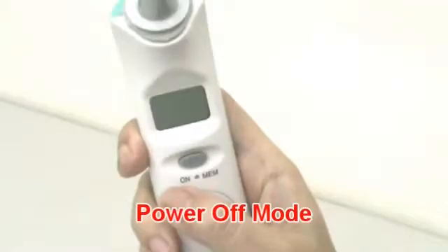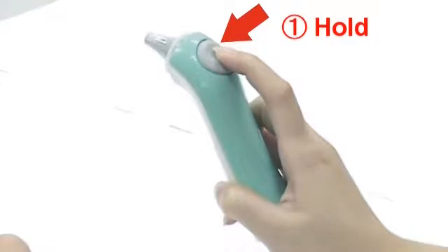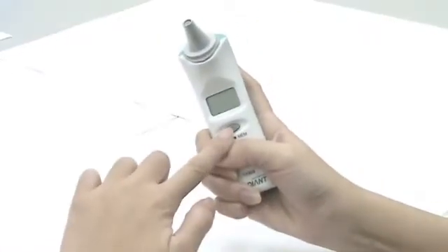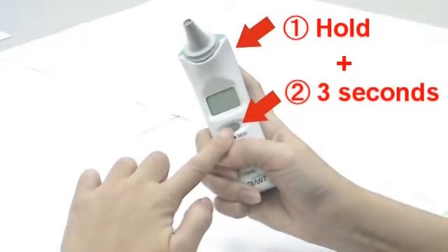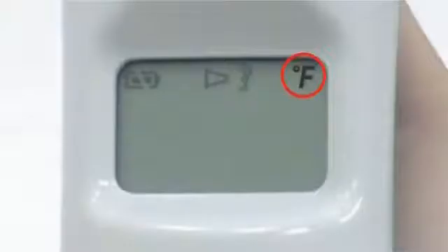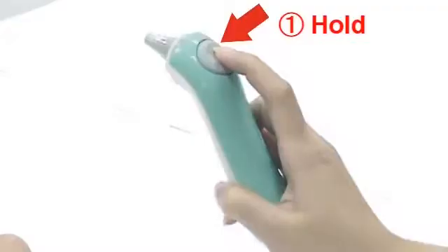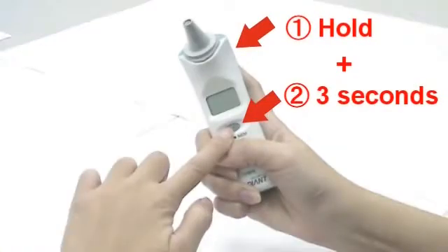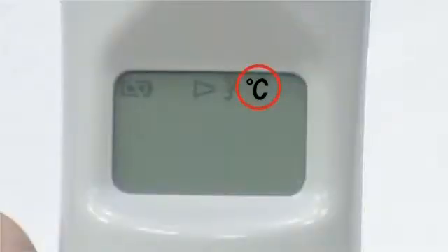In power off mode, press and hold the scan button, then press the on memory button for three seconds. The icon will switch from Celsius to Fahrenheit. You can also use the same process to change the LCD display from Fahrenheit to Celsius.